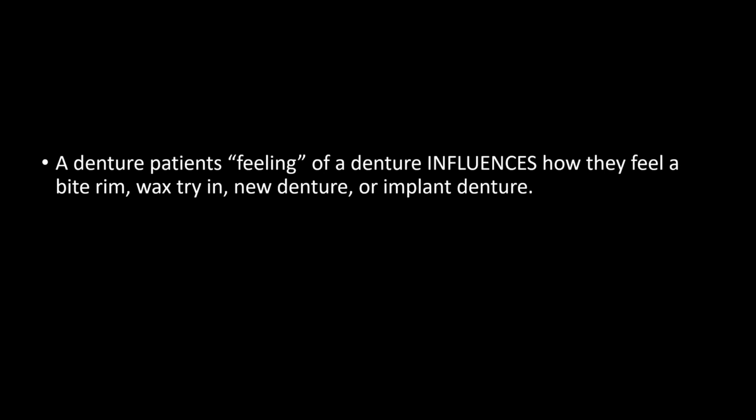So I don't use cure material anymore because it's too rough. It has to be smooth like a denture base on that wax rim. So I've just gotten accustomed to using wax. I've been tinkering around with printed materials. You want it hard and smooth like a denture base, so that it's the same type of feel against the mucosa of the mouth. So these things are all part of that central nervous system and how the patient feels.